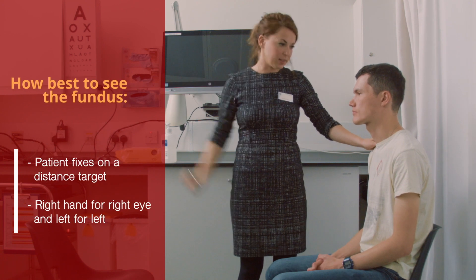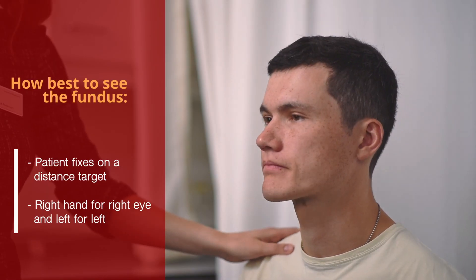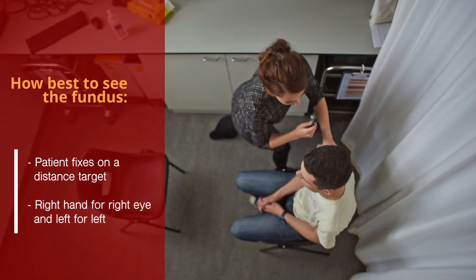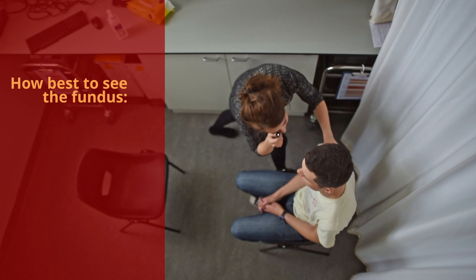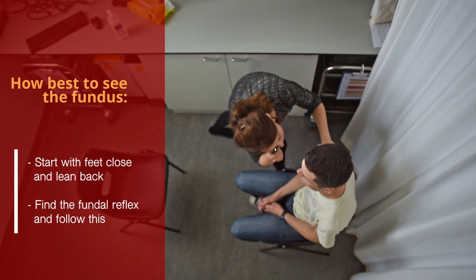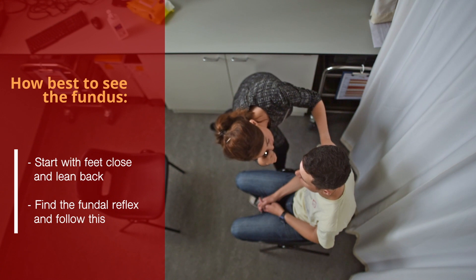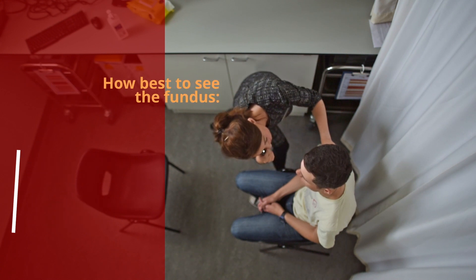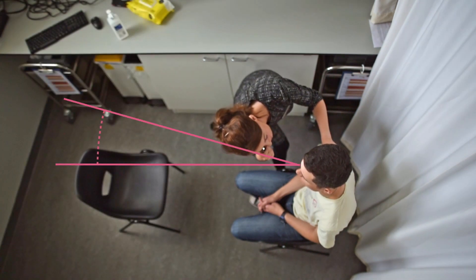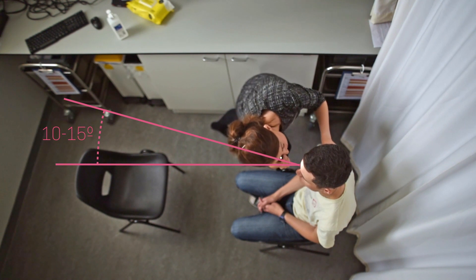Ask the patient to fix on a target in the distance. Use your right hand and right eye to examine their right eye, and your left for their left. Start with your feet close to the patient and lean back. Identify the fundal reflex and follow this, moving in on a path 10 to 15 degrees temporal on the horizontal.